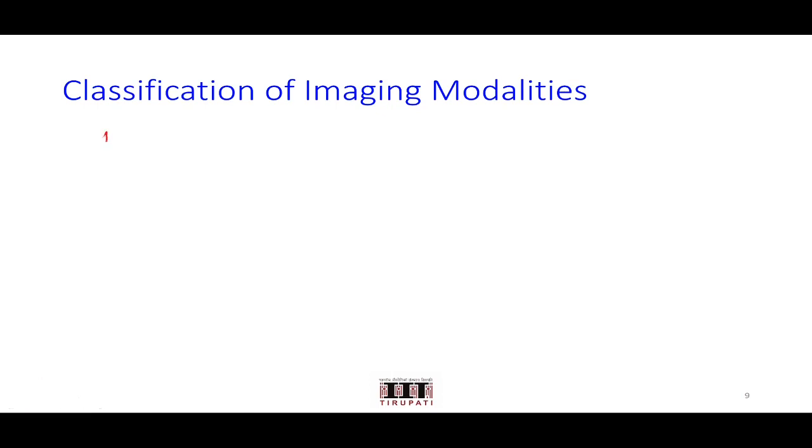So the first category of methods, we are going to refer to them as transmission images that are obtained by sensing the signal that got transmitted through the object. So that we would refer to as transmission imaging. And of course here that's radiographic imaging. That name would become more clear to you as we move on, but for the sake of completion, let me refer to it as radiographic imaging.